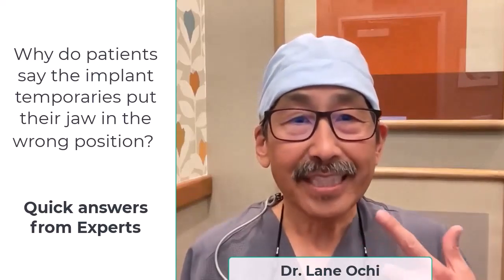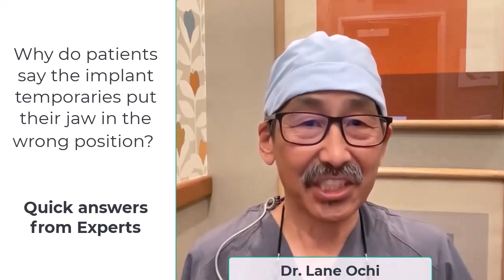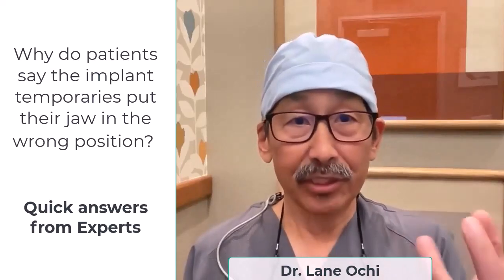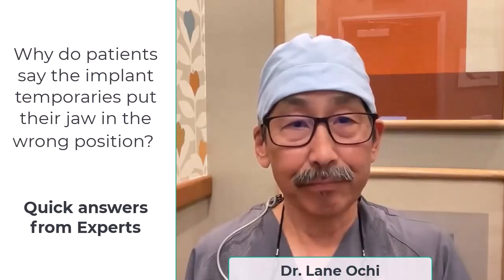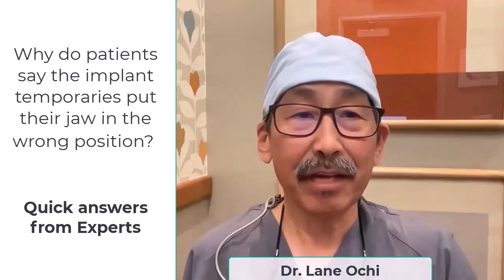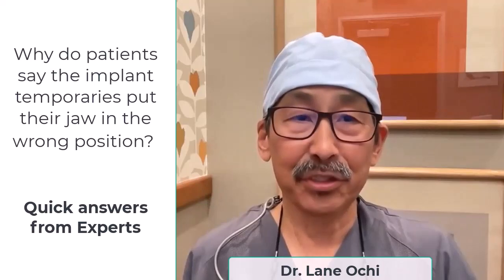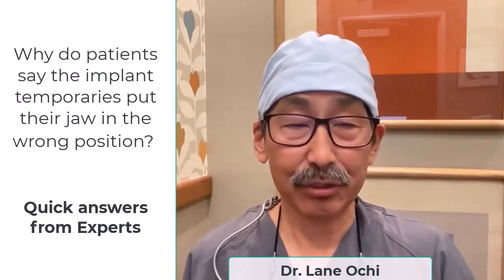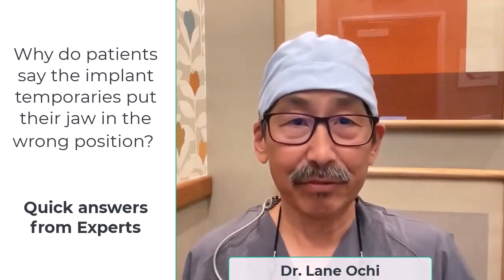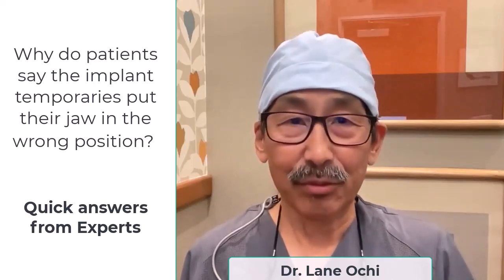So most AP slides occur on the posterior as patients have to move from CR, CO first contact, into MIP. Now this causes the lateral pterygoid to contract and bring the jaw forward. By using a QuickSplint and eliminating those posterior interferences, now the lateral pterygoid can relax and go back to its most comfortable optimal position, and this allows us to establish the occlusion. Once we establish the occlusion, then we can make our patients comfortable in their implant provisionals, and then as we transition them to definitive restorations, everything works out really well and everyone's happy.